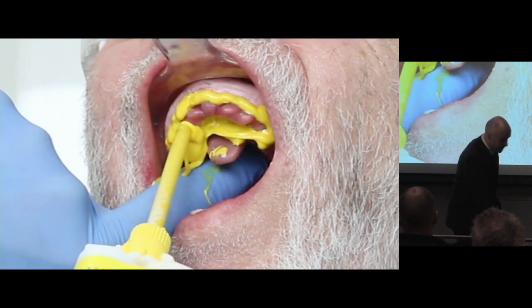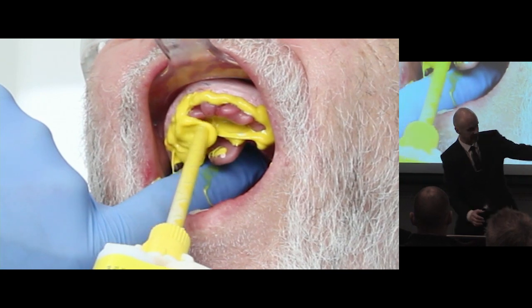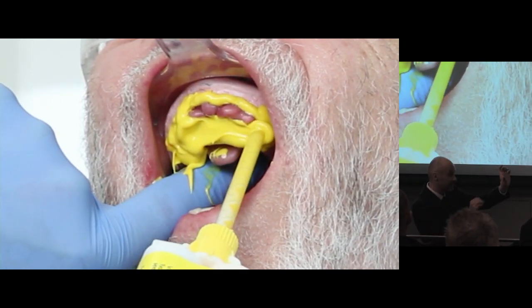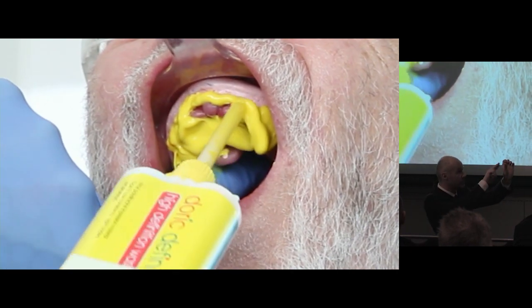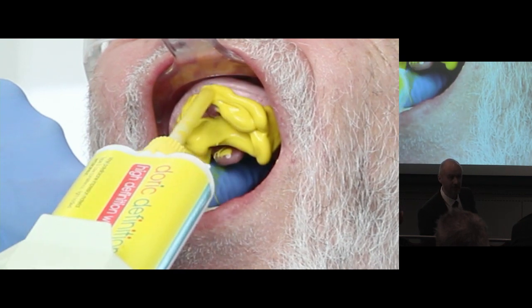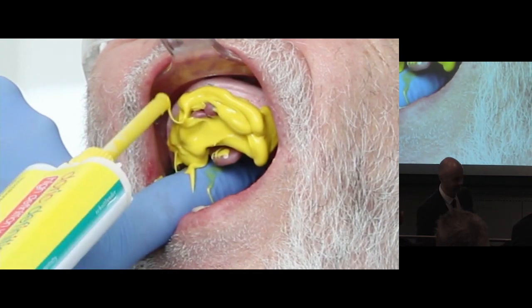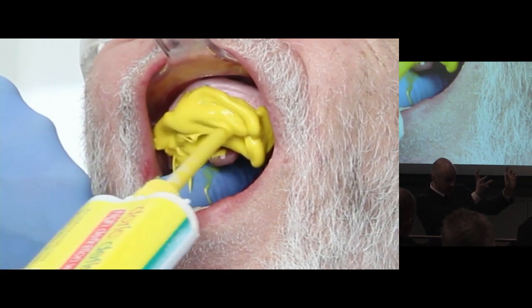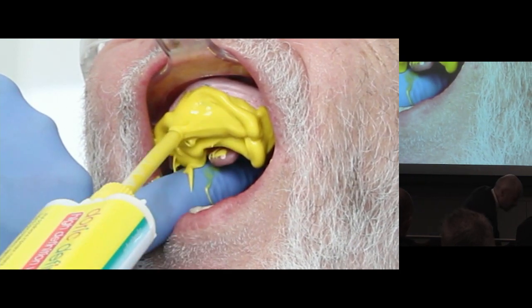And I've actually got the patient almost sitting up. The head's a little bit back. I've got a knee brake chair like this, so I can actually get in close. Just hold it in. I'm just doing it like this, kneeling down. And like we said, I could do knee pads too, it'd be good. But holding that in place, just beading that on. And you can see how loose that was.